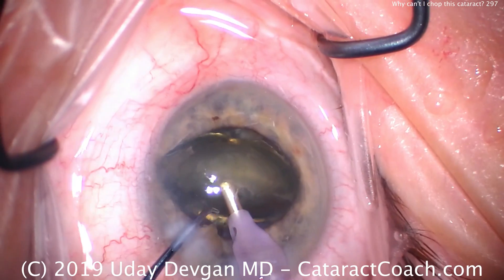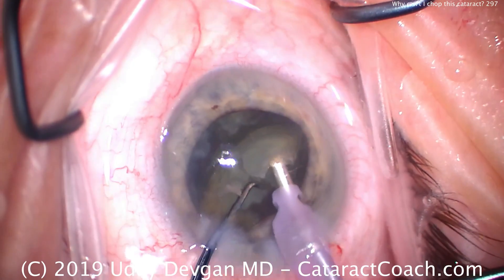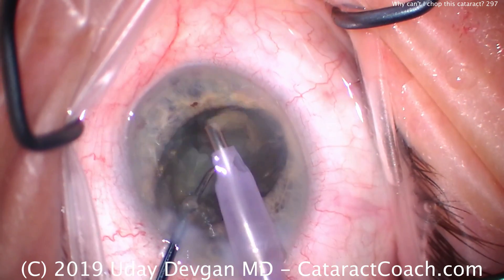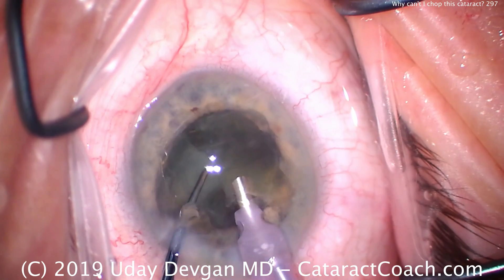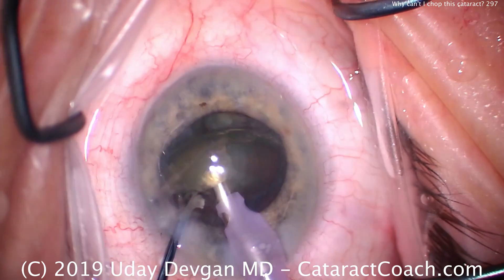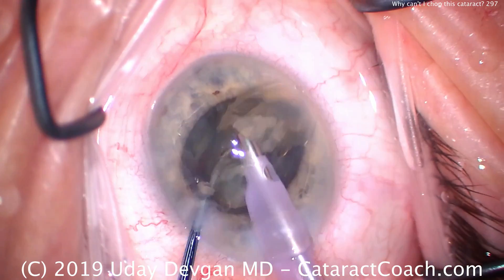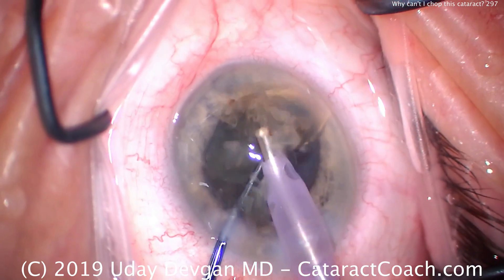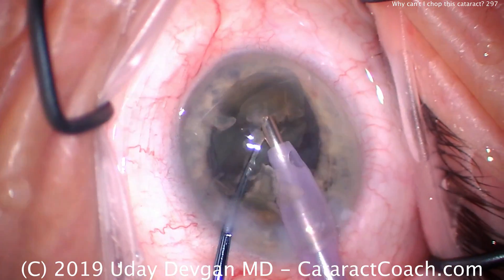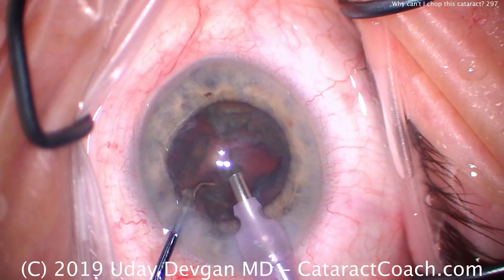Buzz in with the faco probe again. Here's that denser central nucleus, chopper goes around, we'll break it into pieces. Now it's starting to chop a little bit, still not as effective as I would like. This isn't an entirely dense nucleus — it doesn't have that fibrous or leathery quality. It's a pretty traditional moderate amount of nuclear sclerosis. Buzz in with the faco probe again and we can just subdivide it. Finally I'm making some progress and we're removing the nucleus. Still not sure why I'm not having great success, even though the answer is right there, right in front of me.